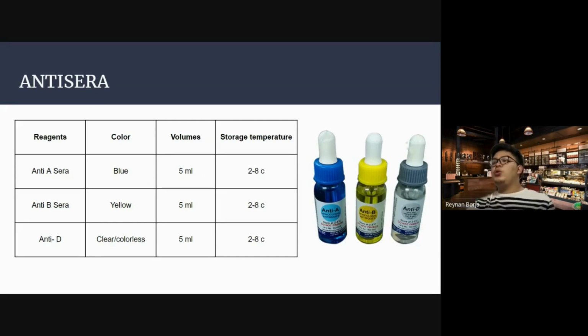Okay. So, ano yung mga dyes na ginagamit for different anti-seras? So, different books, different sources, different manufacturers, different pronunciation, sabi nga nila. So, iba-iba yung ginagamit nila. Pero usually yung nababasa ko sa books and other datas, pag color blue yung dye, ginagamit is trypan blue.